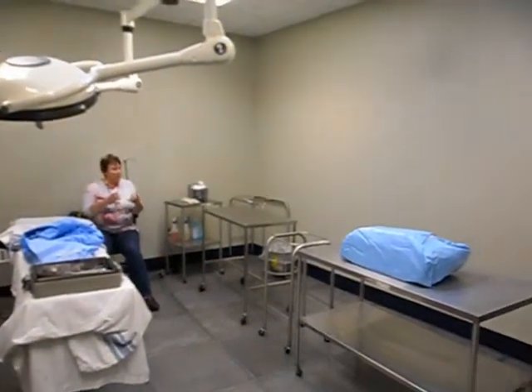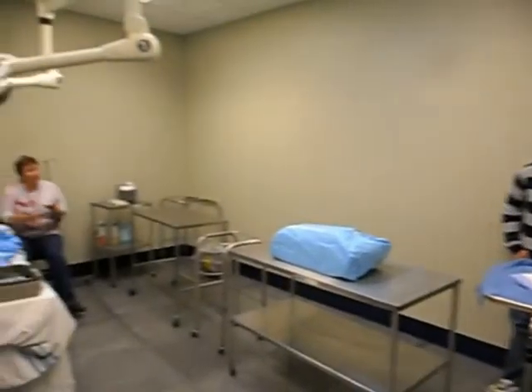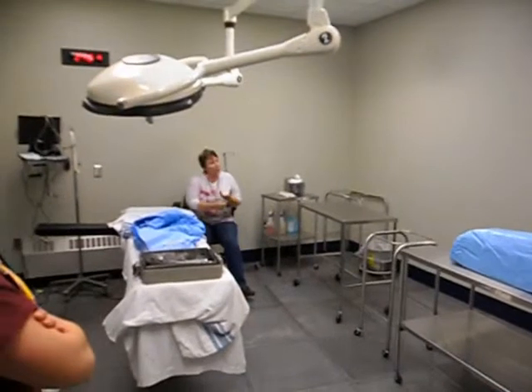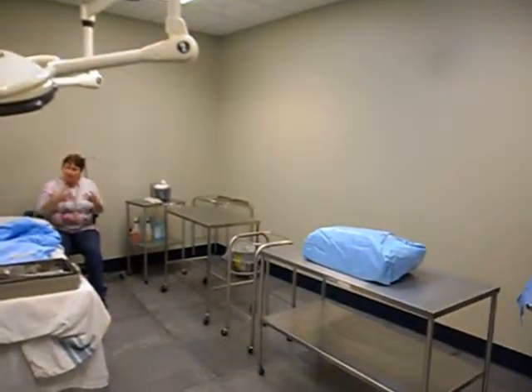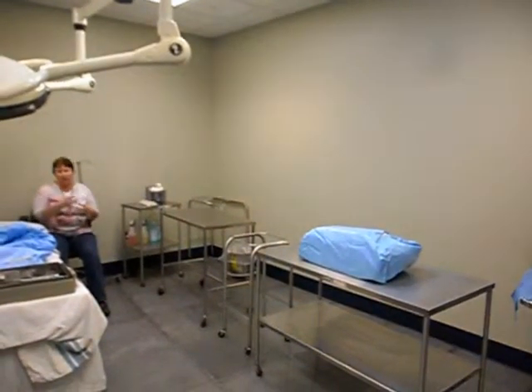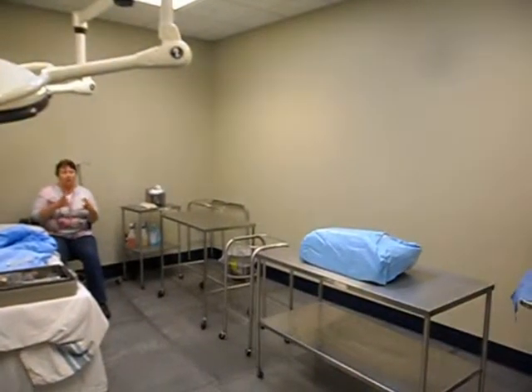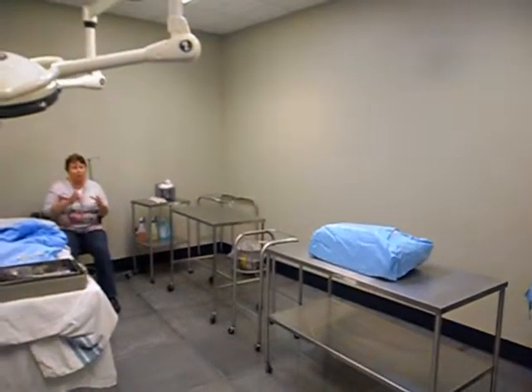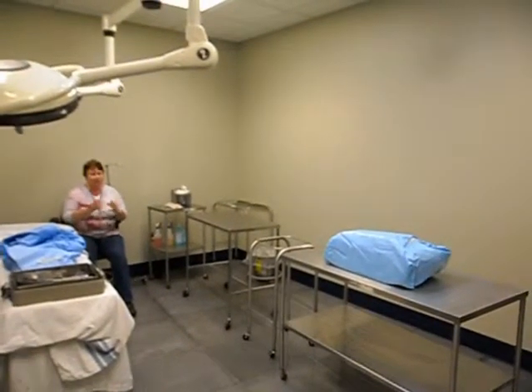Like Babcocks. Babcocks to grab, right. Probably right angles. Vessel loops, maybe clip pliers, maybe some Kittners for this kind of case. Okay, now this is a big case. This is a huge case. We're going to be doing a lot of manipulating, a lot of working in the abdominal cavity, peritoneum. What did we talk about in these kind of cases where we're doing a lot of manipulating, what might we need towards the end of the case then?